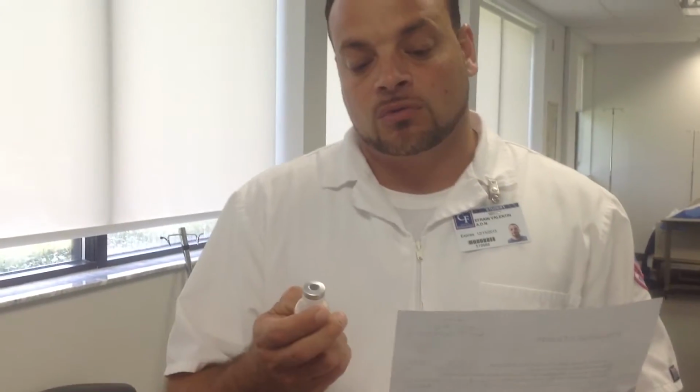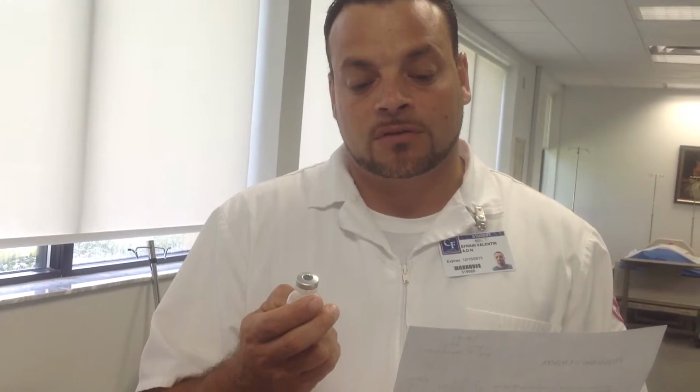And after my calculations, I have come up with 0.8 mLs to be injected into the ventral gluteal or vastus lateralis, because this medication strictly says in the drug book not to give in the deltoid site. And we will be trying to use the Z-Track technique. It's recommended for this medication.